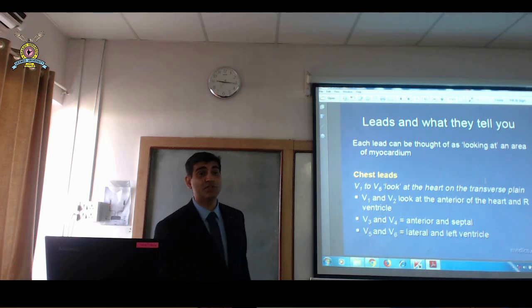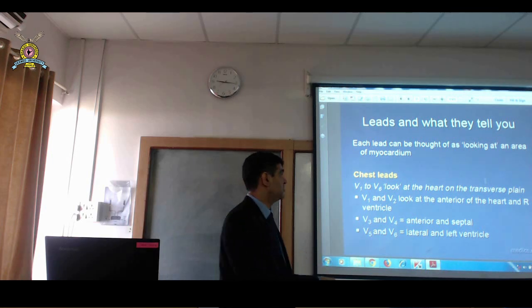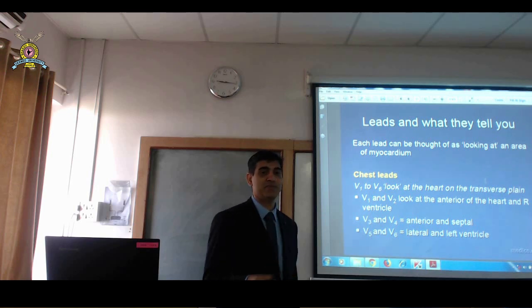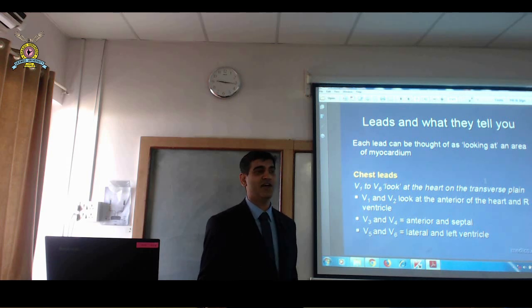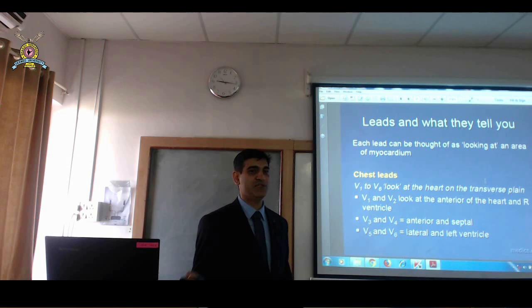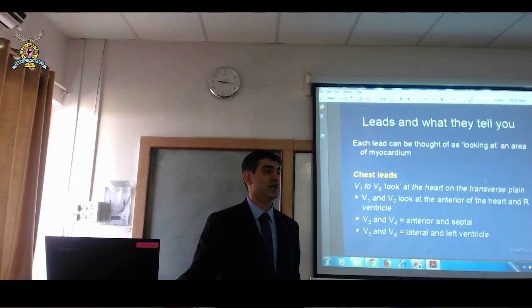Sometimes in pulmonary embolism patients, you will have ECG changes. That's the importance of this information. The right ventricle is located on the front. You may get confused with a heart attack, but actually it's a patient with pulmonary embolism. The doctor will go and do an angiography, and you will not find anything. The patient has come with chest pain, breathlessness, and low saturation, and a not so well trained doctor thinks this is a heart problem because ECG changes are seen, and then he does coronary angiography. He finds normal coronary arteries and leaves the patient thinking the coronaries are normal, and then the patient dies the next day because the patient has a pulmonary embolism.